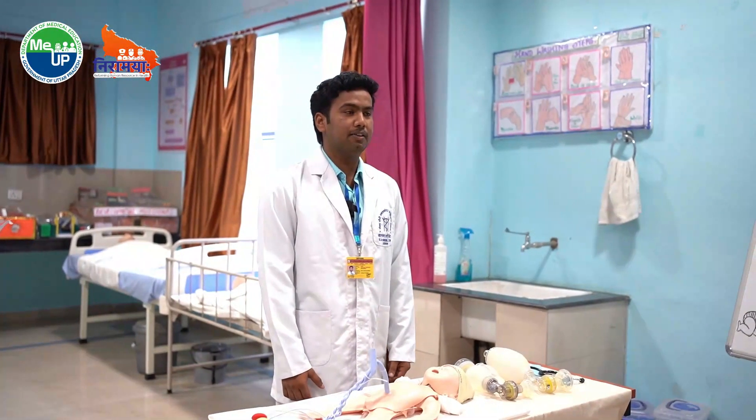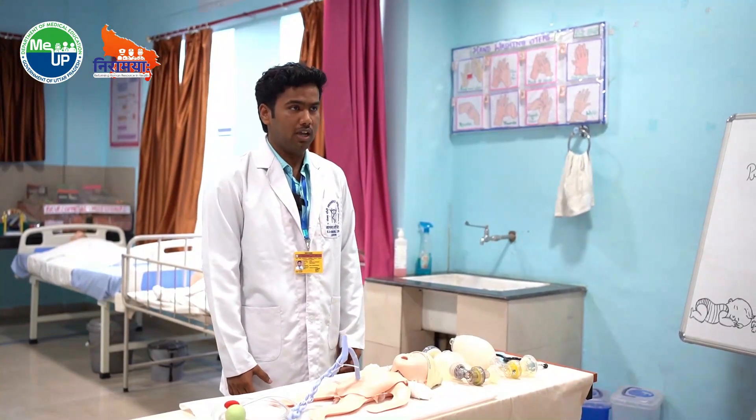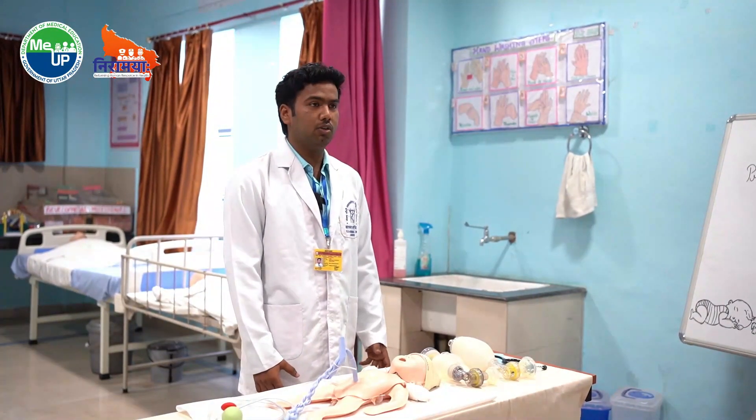I am Vikas Kumar, BSc Nursing fourth year student of College of Nursing SGPGIMS. Today I am going to show you the procedure of neonatal resuscitation.